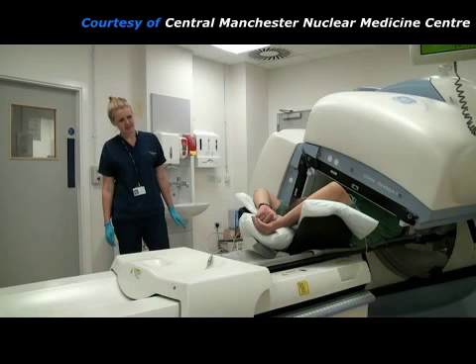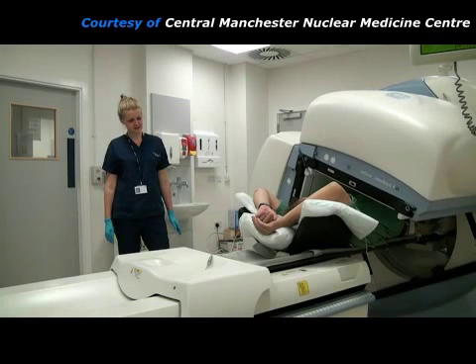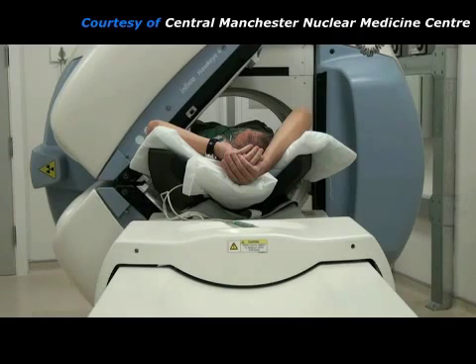During this time, the practitioner will be watching from close by, even though the patient may not be able to see them. After about 20 minutes, the gamma camera detectors will have taken their last pair of pictures and then they move away from the patient.